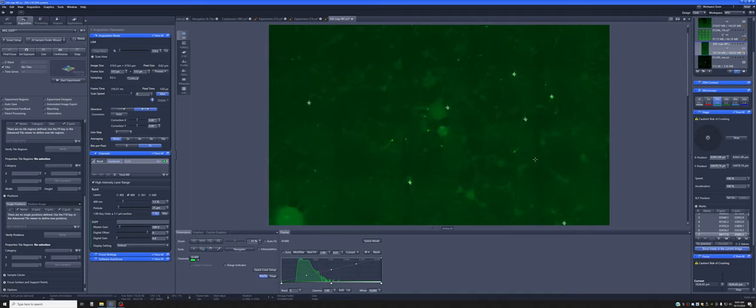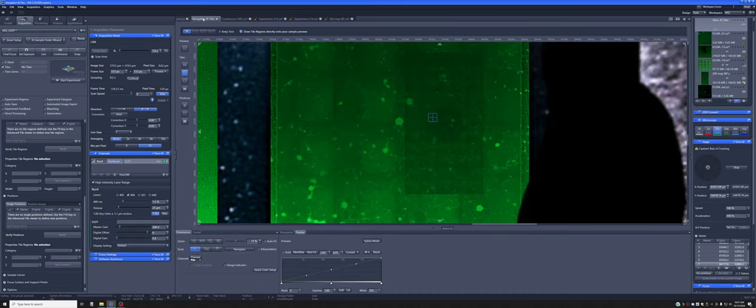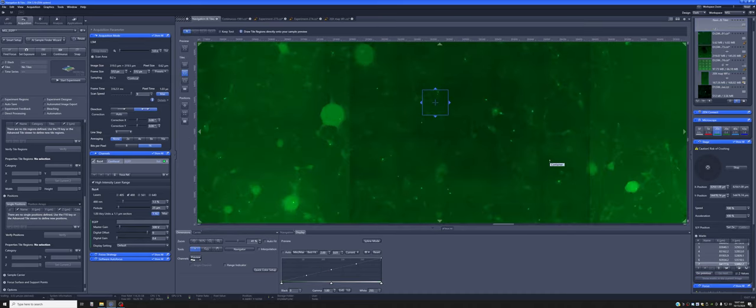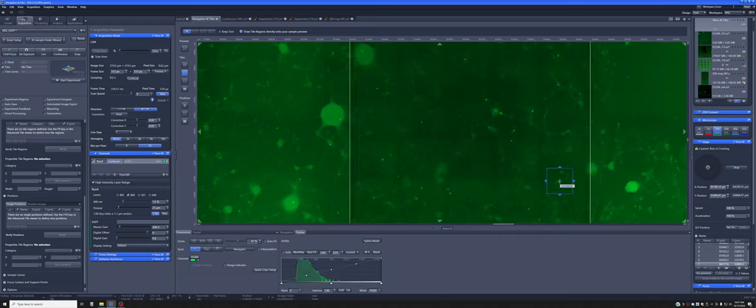The other way of adding marks is if you're in the navigation and tiles. Maybe you were interested in this one. If you go there, once you go there you can click on this plus sign and it'll add a mark wherever you are.